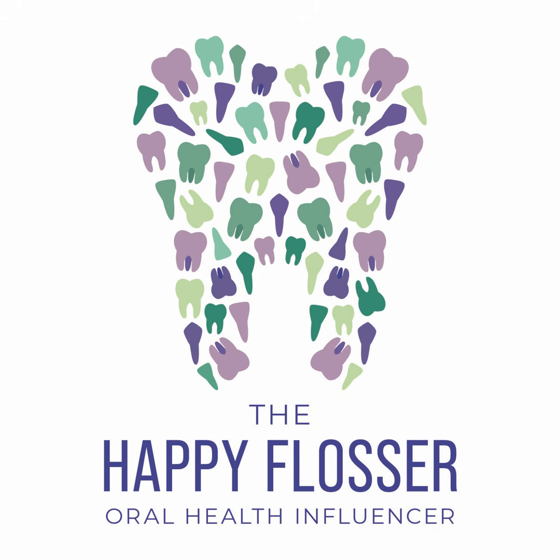And the other part of preparation that goes such a long way in creating a good impression with your patient is the size and the fit. Make sure that the tray is the right size for your patient. So dry fit it just to make sure, because it's a lot harder to find out after you already have the alginate in the tray and you're trying to seat that in the patient's mouth.